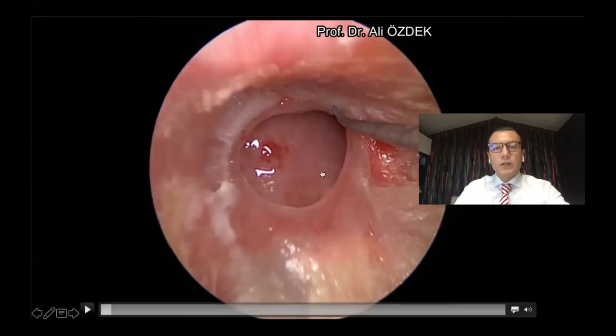We use the endoscopic technique because the endoscope gives some advantages. Endoscopically, we perform all the surgeries from the external ear canal without making any incision. The endoscope also provides better visualization of the tympanic membrane and better illumination of the surgical area.